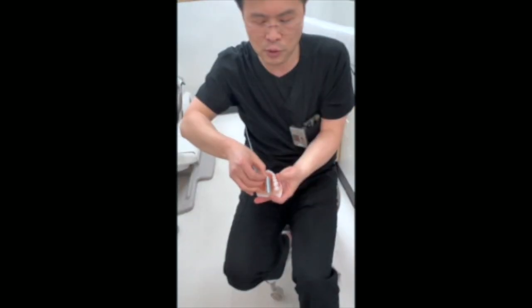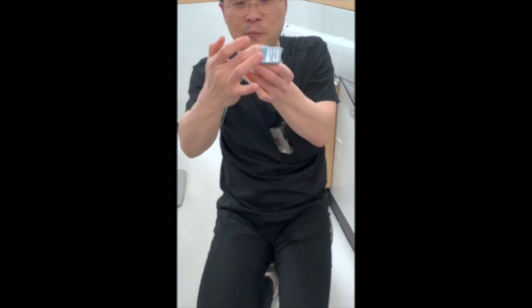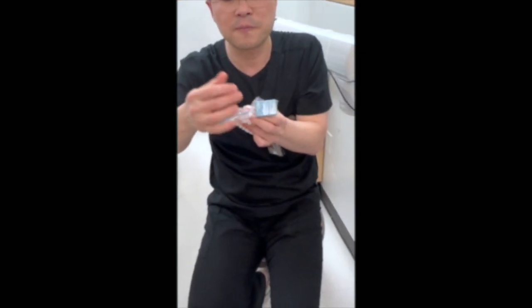It's difficult to place the sensor directly next to the teeth because of its rigidity. So you may not be able to see the premolar exactly. It may be on the side. So how do you get it pictured directly in the center?